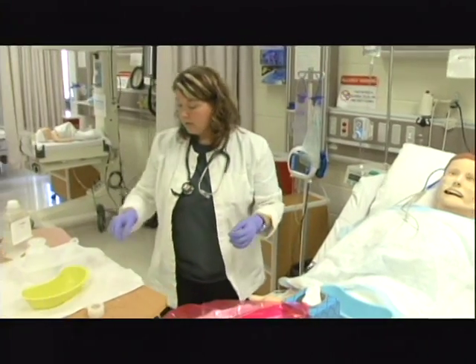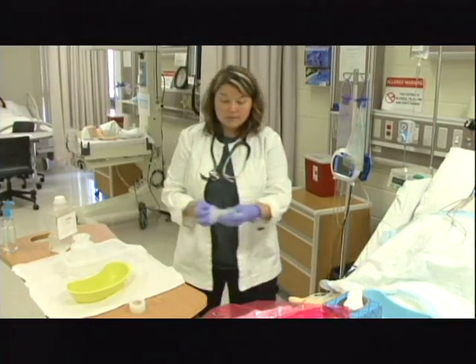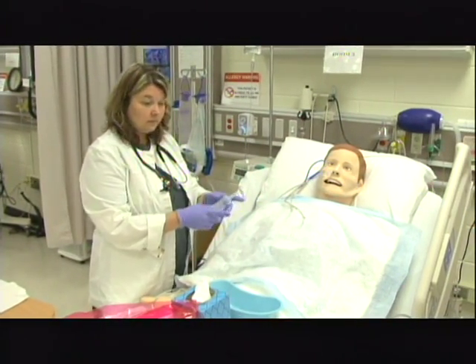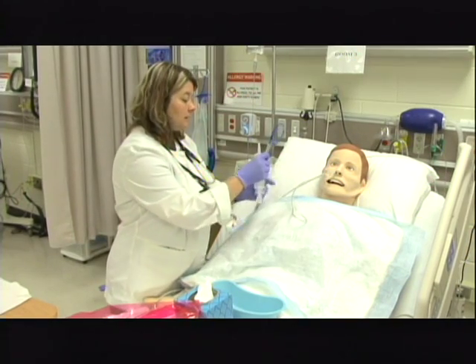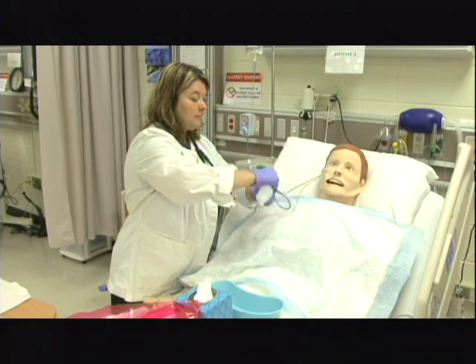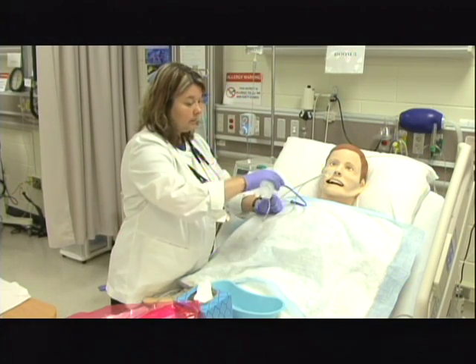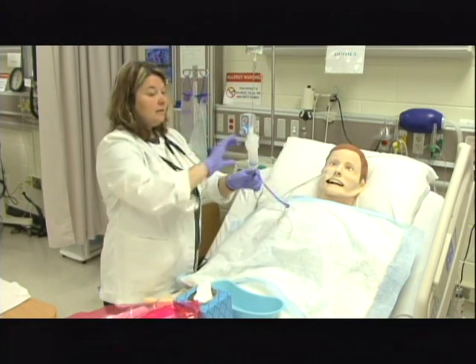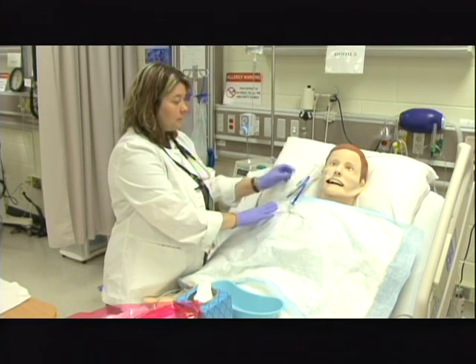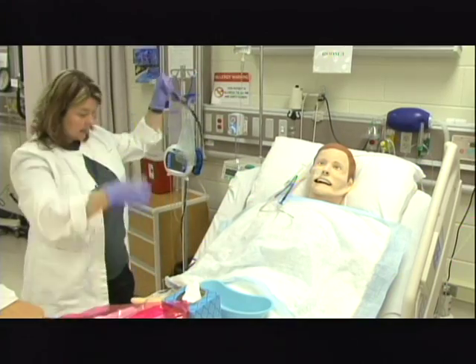I've now measured. I'm going to come over here and with my piston irrigation syringe, I'm going to pull up the 5 to 10 milliliters of air based on facility policy if they're requiring this. I'm going to clamp the tube. I'm going to take out the anti-reflux valve. Of course, all of this without pulling on the patient's nose. Now that I've got the actual piston syringe in here, I can lay this down for a minute since the syringe is still in there and attached.